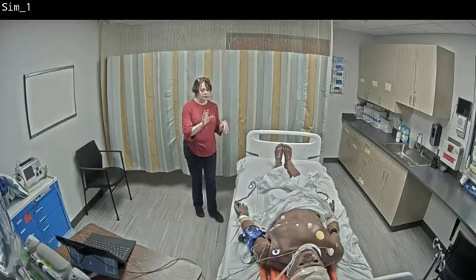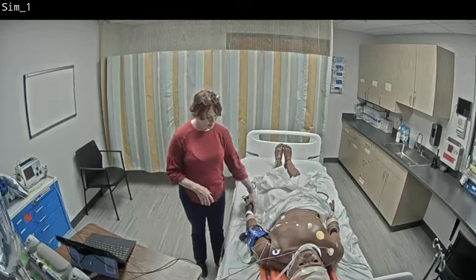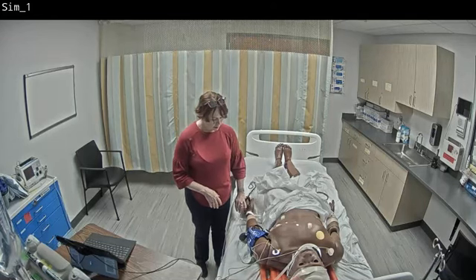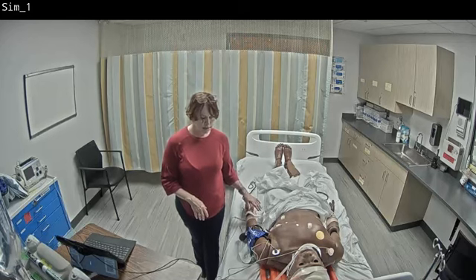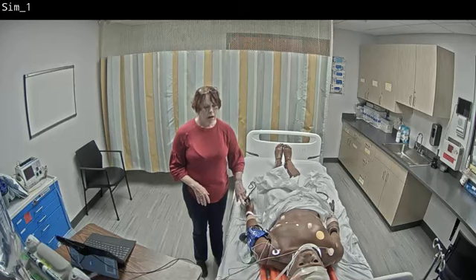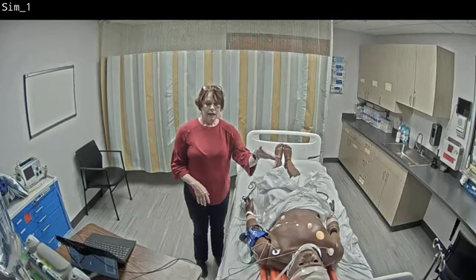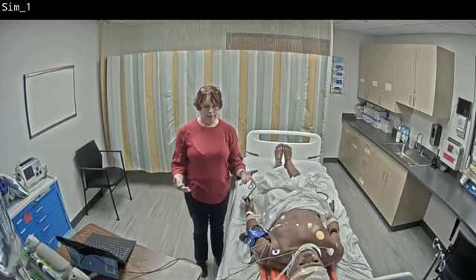When the simulator is on, you will come into the room and talk to him. This one does have an ID band. You can verify his name and medical record number. In simulation, the ID bands do not have the birth date on them. We will not be speaking as the simulator for you in skills. We only do that in simulation.